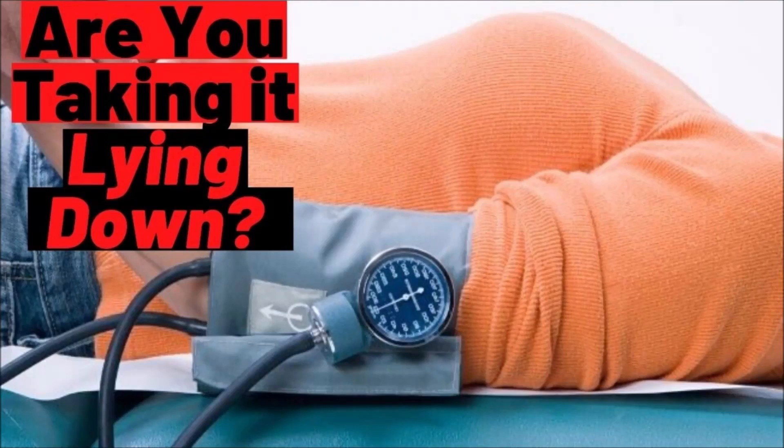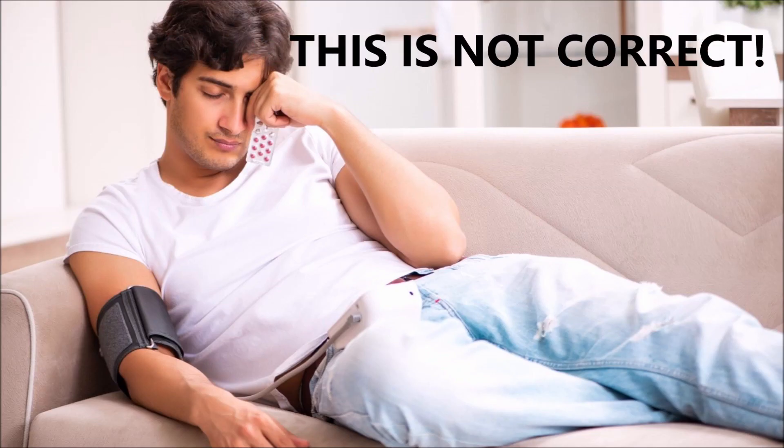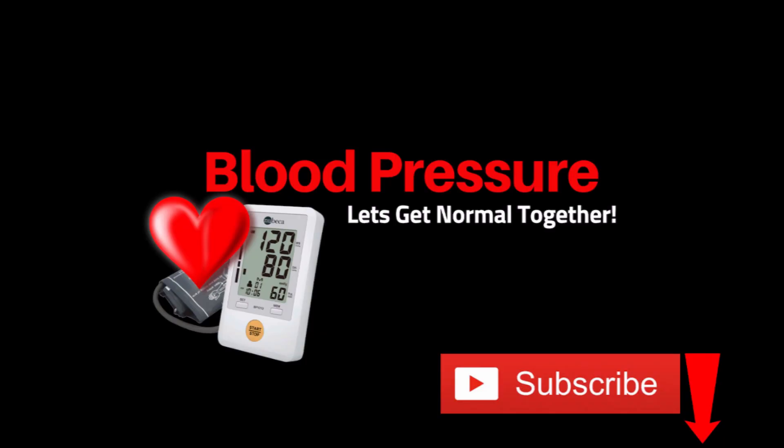In this video, we'll discuss blood pressure lying down. Why would you take it lying down? I'll tell you why some people have to, how to do it correctly, and are the readings different versus sitting up?